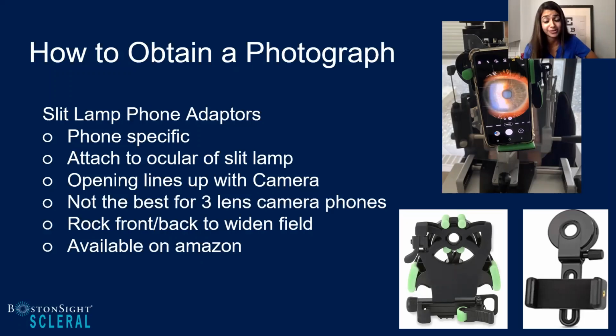And the beauty of these adapters is they're economical. So really going on a resource like Amazon, which is really available across the world, and investigating what's going to work best for you and understanding what's going to fit not only your device, but also your slit lamp. This image here at the top is of our second exam room, and this device is called Hookups. We got it on Amazon, and I think I paid $30 or $40 for it back in the day when I got it.